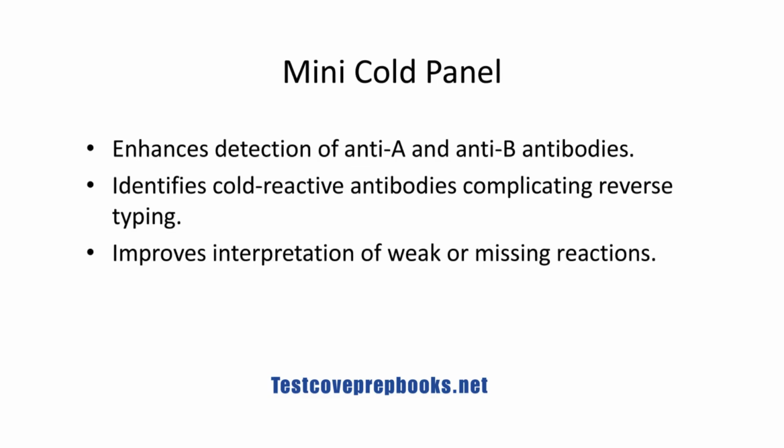The mini cold panel. In blood typing, particularly within the ABO system, there are instances when expected antibody reactions do not appear during standard testing at room temperature. The mini cold panel is a specialized technique designed to address this issue. This method serves two important purposes.